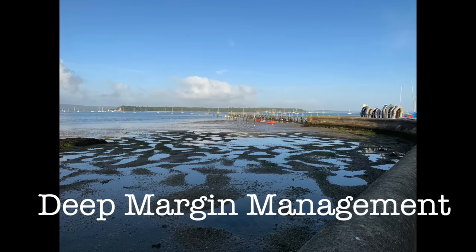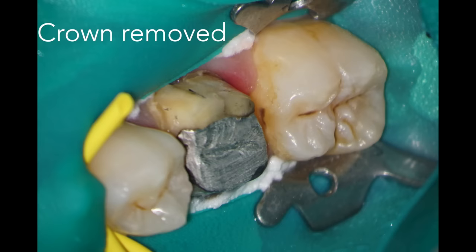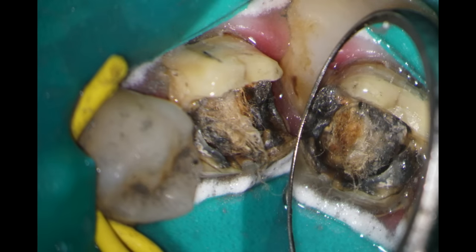We're going to start with some disassembly and management of the lesion that's present on the distal aspect of the tooth. Obviously, in a case like this, we need to remove the cast restoration, and in fact, I'm going to use it as a temporary at the end of treatment. So I've removed the crown, I've now removed the amalgam, and here you can see some very old cotton wool that's lodged in the pulp chamber from the previous root filling.